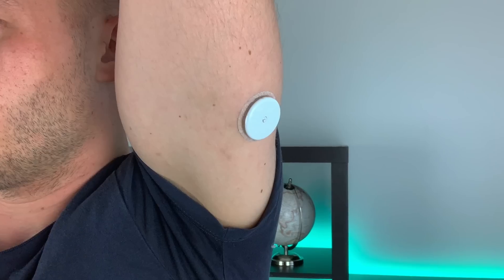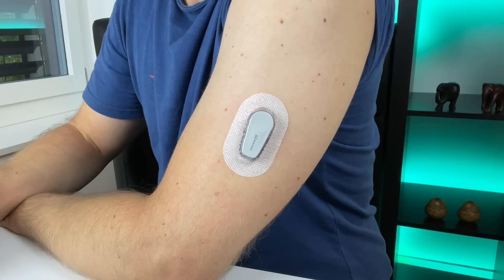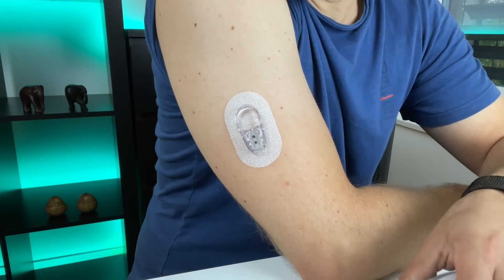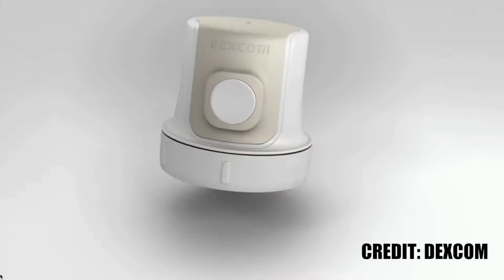When picking the best CGM, the first thing I look at is how the device looks. This is Freestyle Libre 1, this is Libre 2, this is Libre 3, and this is Dexcom G6. Sorry Dexcom, but Freestyle Libre is a lot more sexy — and I want my CGM to be sexy because wearing a CGM is sexy.